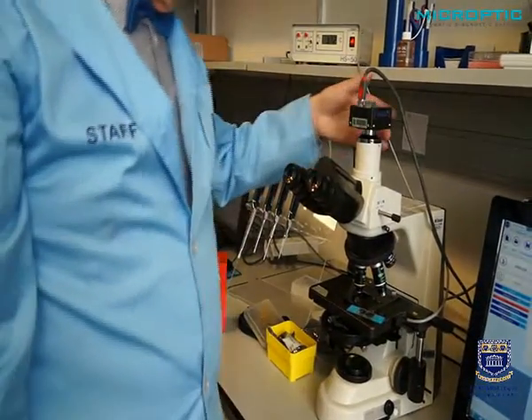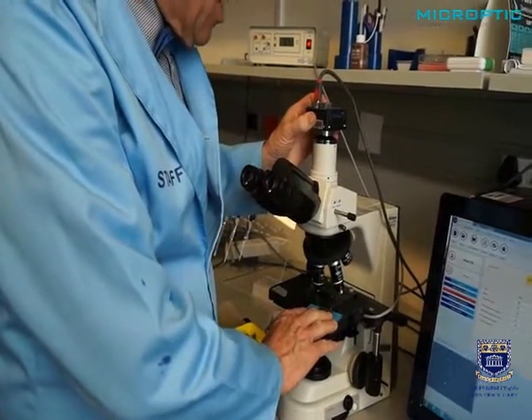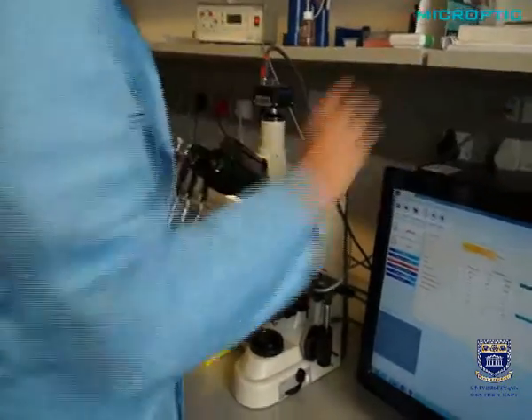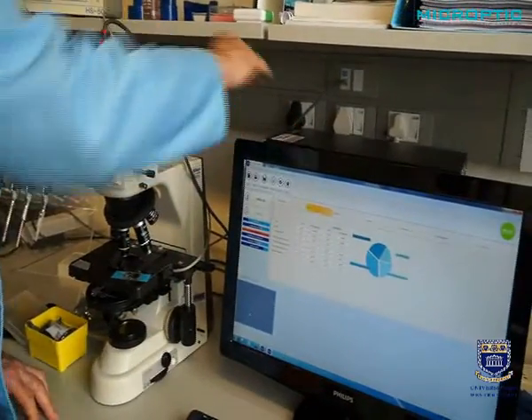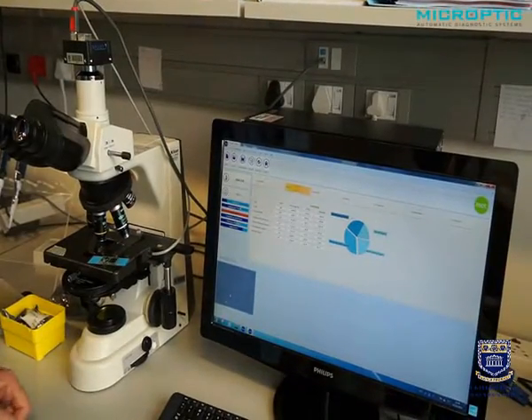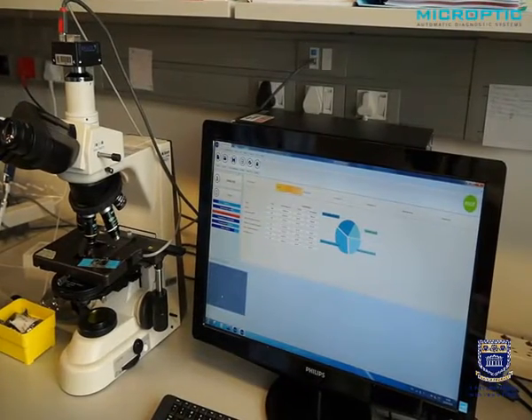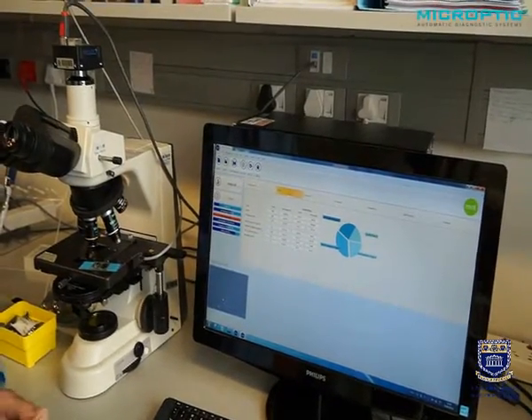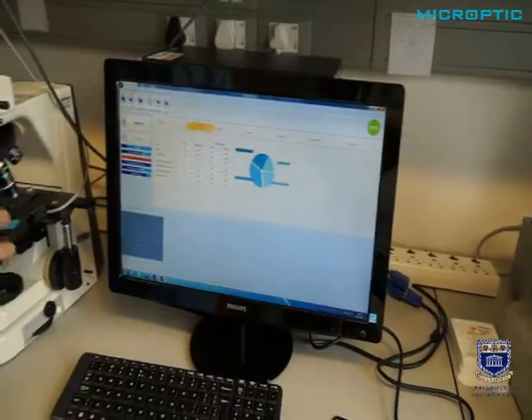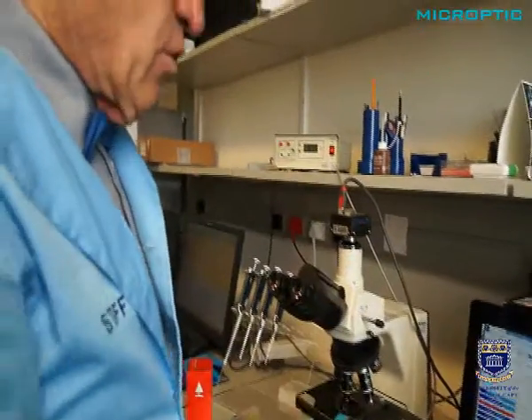The next step is that this signal, for example the motile sperm, is now fed into your computer. And again, here one must take a great deal of care. You cannot just use a computer with any settings. It's preferable to use a Hewlett-Packard computer with lots of RAM and very fast processors, and make sure that if you work with Gigabit Ethernet it has the proper Gigabit Ethernet card at the back. So those are the absolute important requirements for being able to start your work at all.